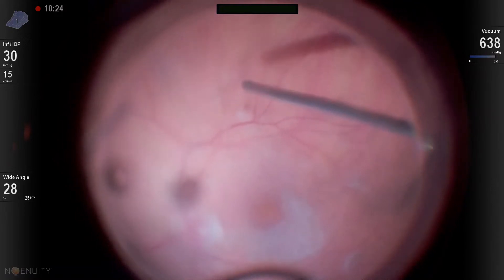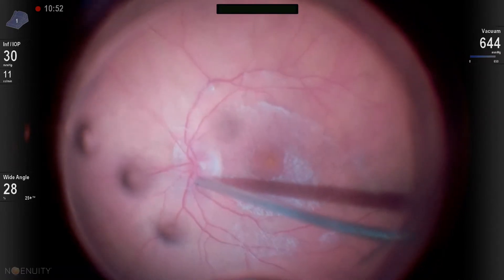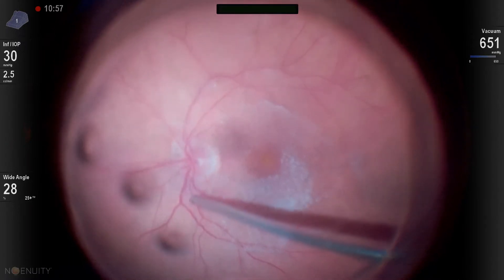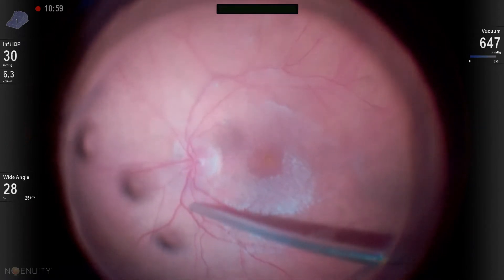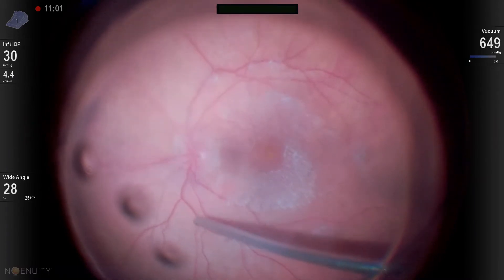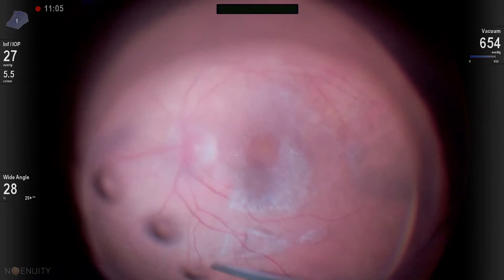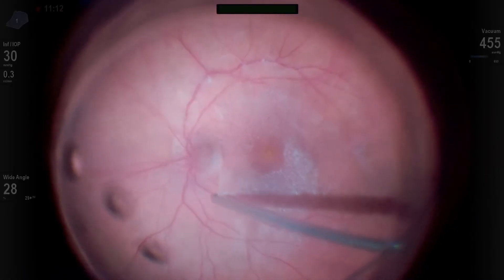Here you can see I'm trying to peel up and out along the eye wall. I didn't get it there, so I go to the superior nerve edge and get good occlusion with a nice five-to-ten seconds of vacuum, then peel up and out. Now I've created a little bit of a defect in the vitreous there at the optic nerve.